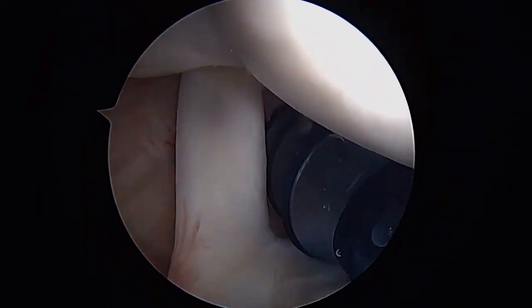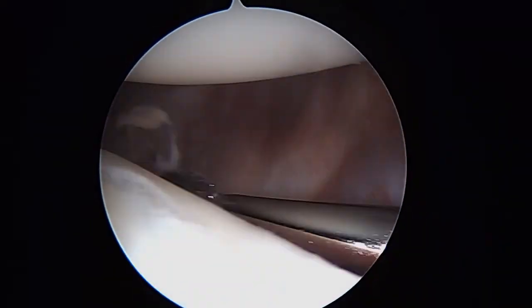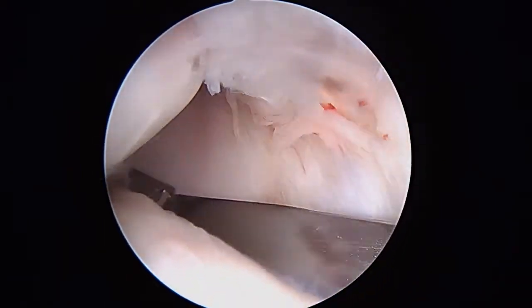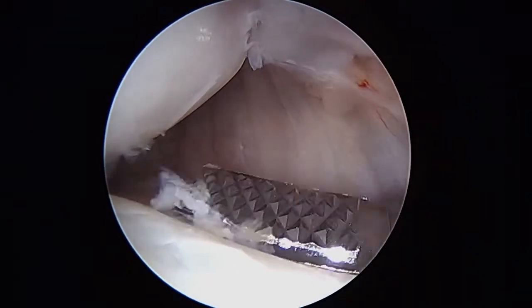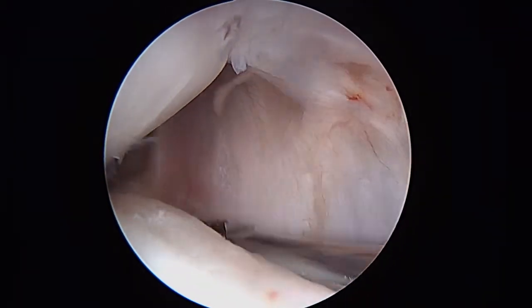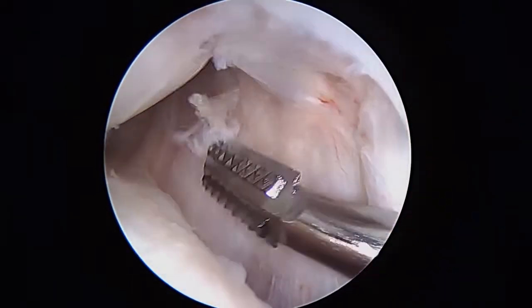So we're going to get to work. We're going to put the camera in the front and show you how we start to fix things. Now we're looking from the front to the back. This instrument that you see is a rasp, and this allows us to just gently roughen up the posterior capsule — we bring this in here and gently sweep like this to basically make this like a piece of velcro so it gets really sticky. This is the back of your shoulder. This ligament here doesn't have a lot of tension on it — that's the posterior band of the inferior glenohumeral ligament.